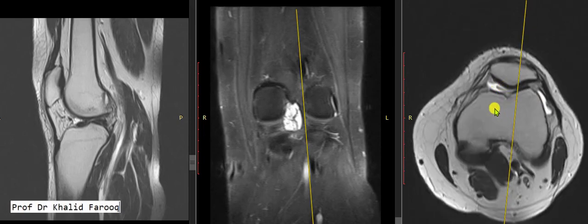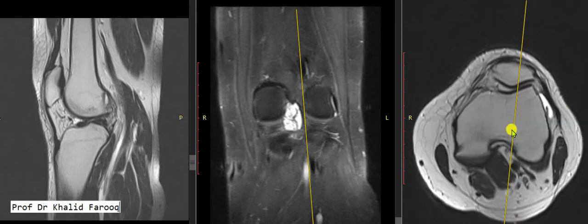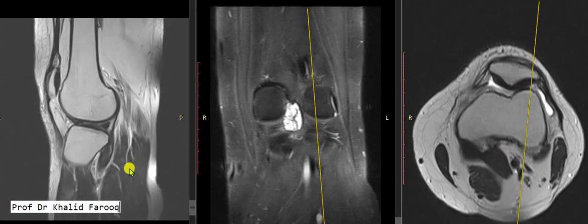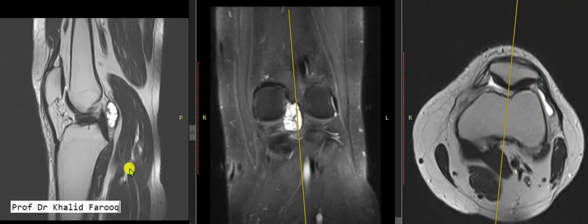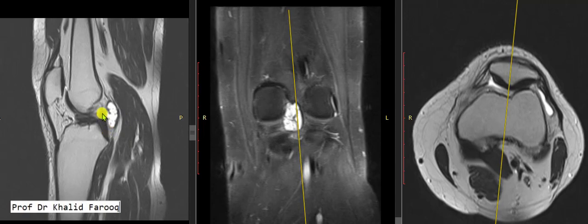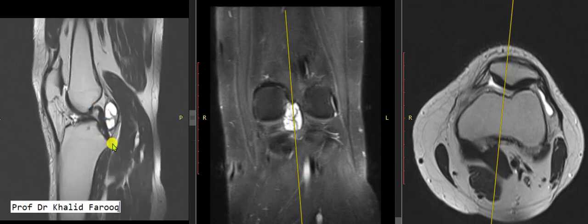A very tiny strip of reactive fluid is appreciated in the suprapatellar bursa. Overall, the patellar retinaculum and retropatellar cartilage are unremarkable. In summary, this case demonstrates a total chronic ACL transection with a multi-septated ganglion cyst along the posterior aspect of the posterior cruciate ligament, and a very tiny strip of fluid in the suprapatellar bursa. Thank you very much. Assalamu alaikum wa rahmatullah.